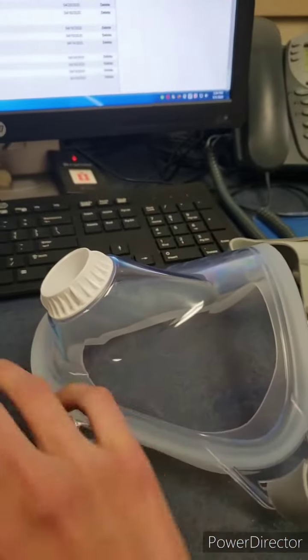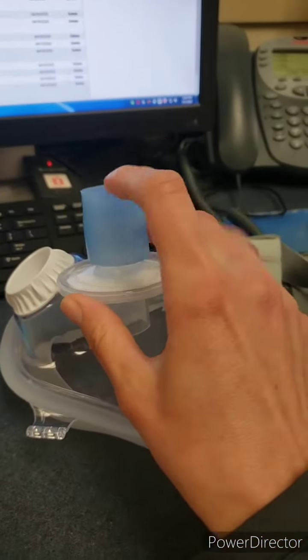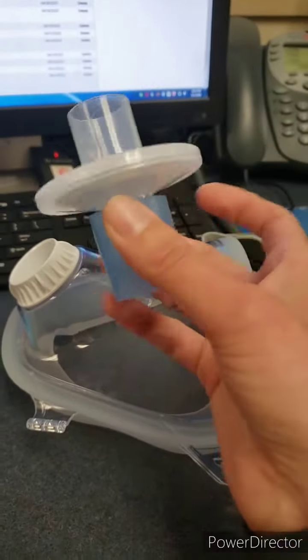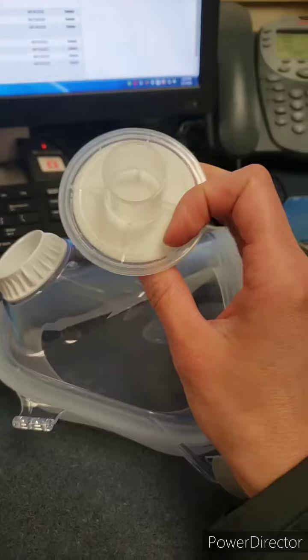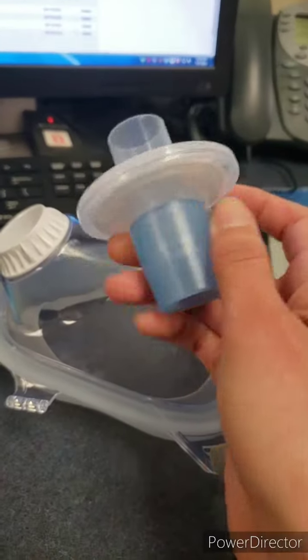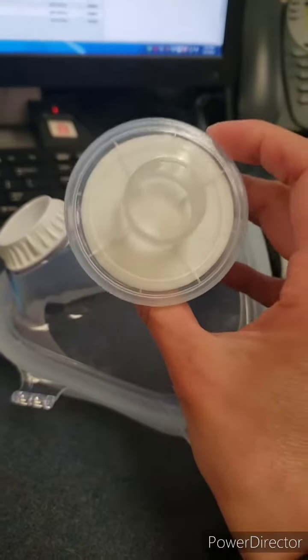This blue piece you never throw away. The filter goes inside of the blue piece. This filter is good for 24 hours of use — that is 24 hours of physical use in the room.